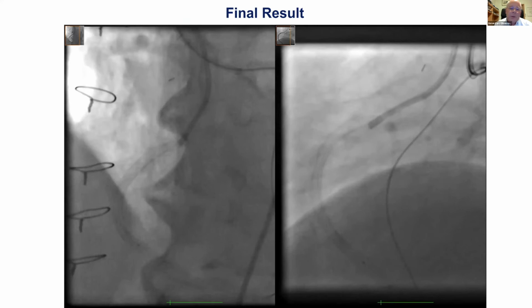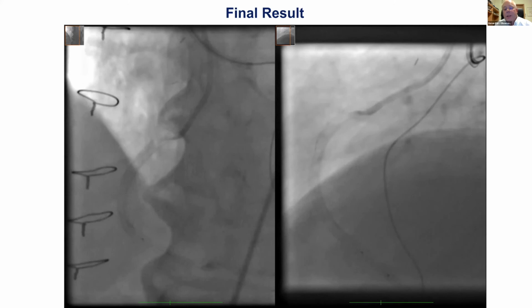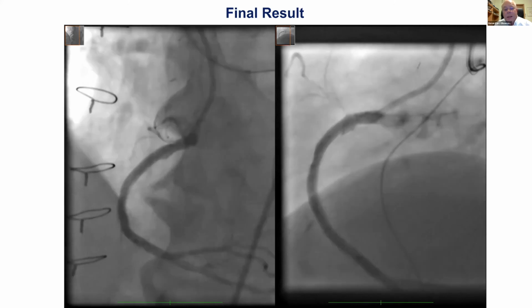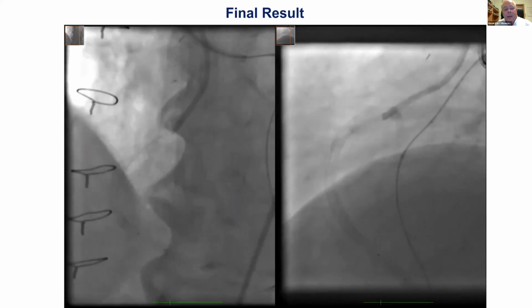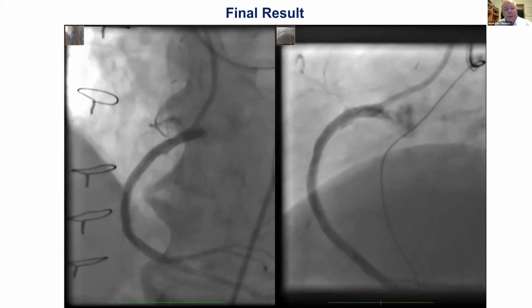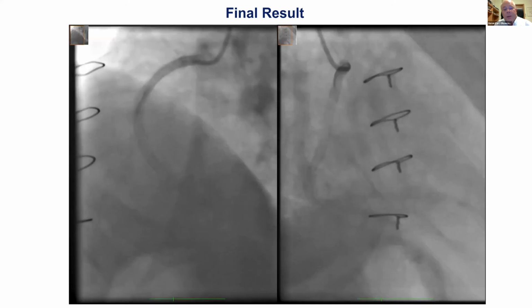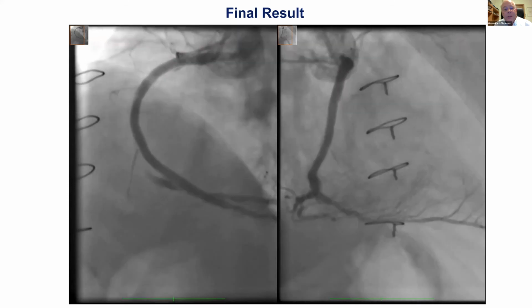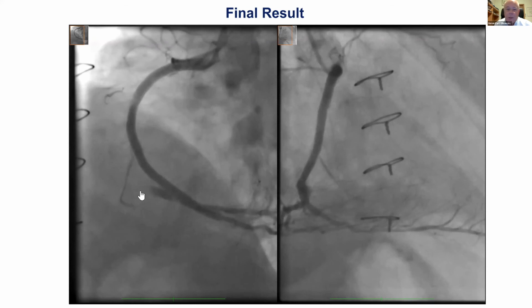Takes a little while for it to play, but you'll see that this is then the very, very large right coronary artery. And we can also, in the next image, you can see a little bit where the actual vein graft attaches itself, or did attach itself, to the next image here. It was very, very close to the right coronary, or to the crux. This is the old vein graft right here that's filling. So this is then the result.